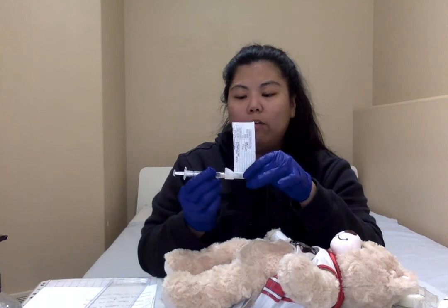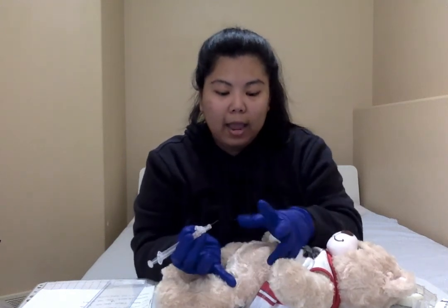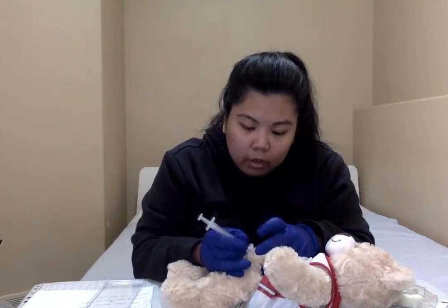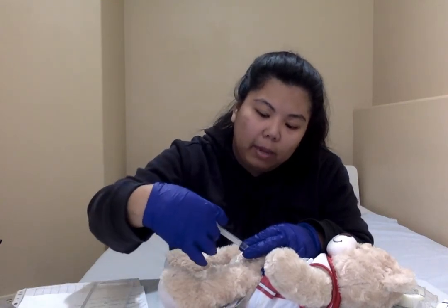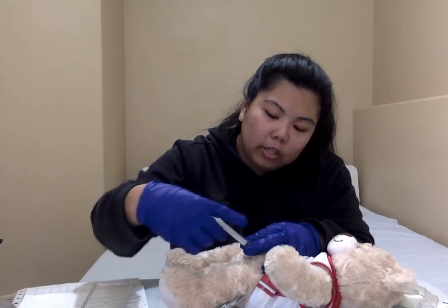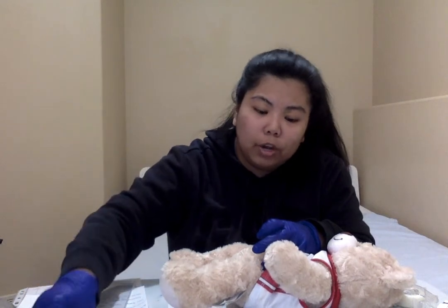I would just pop the cap off of this and make sure that the bevel is facing up. And then now that it's dry, we can grab our skin and then inject at a 45-degree angle. And then stabilize our needle. And then inject the medication slowly, not letting go of the grasp while we're injecting the medication. So now that the medication has all been injected, we can remove our needle and then activate the safety device. This will just go into the sharps container.